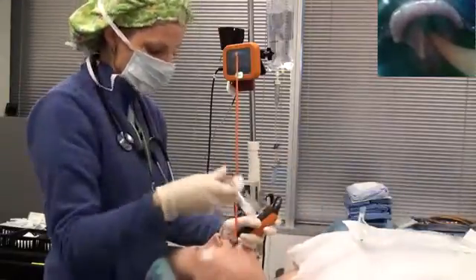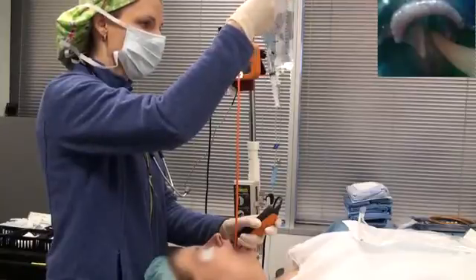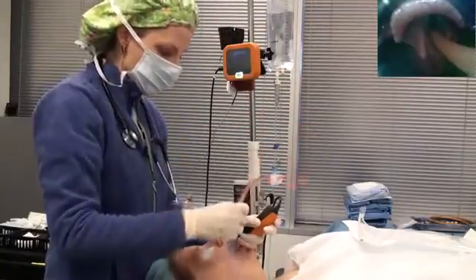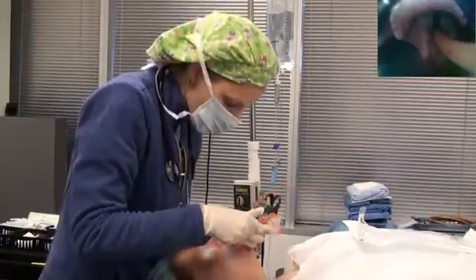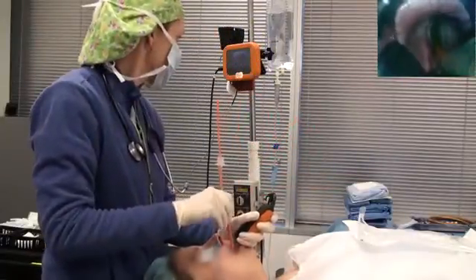If you leave it in the channel it will hold it for you, and then you just slide your tube over the top. Pop it out of the channel and then watch your tube again as it slides down there. I've got a little bit of KY to help assist in the sliding.